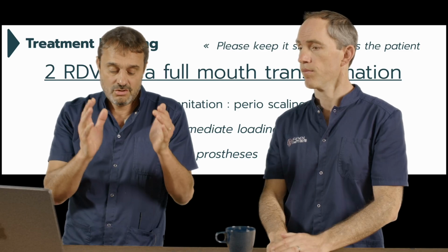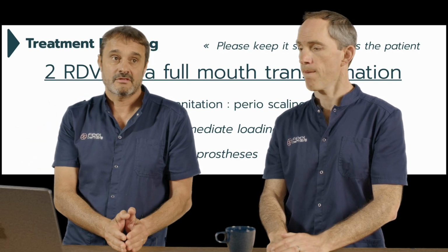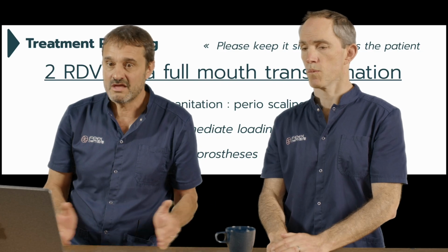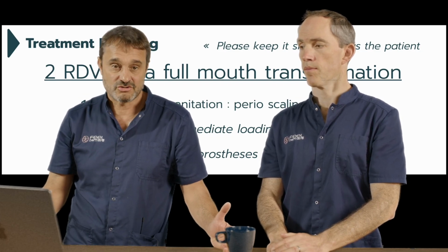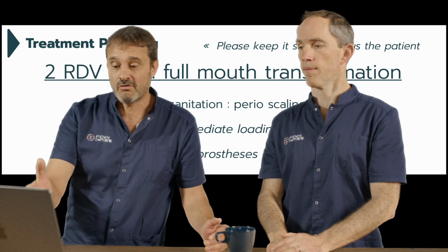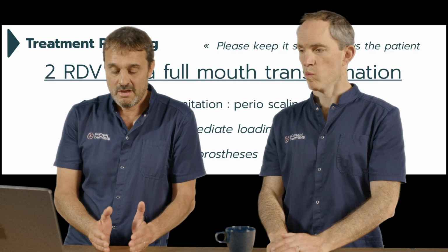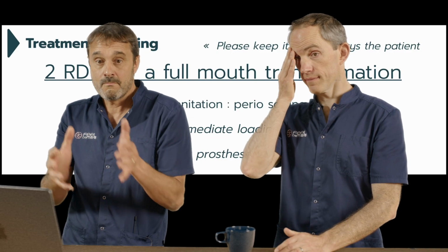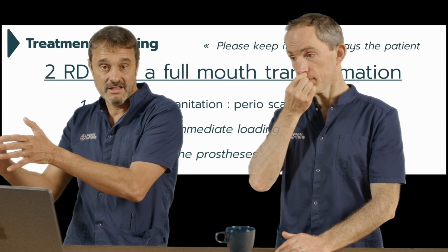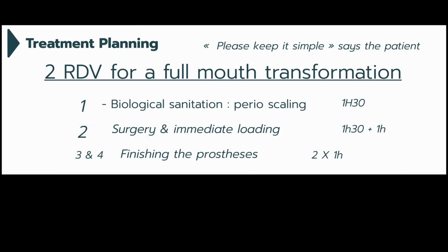Because you have a good organization, and thanks to digital, a treatment that would have been done without digital in maybe 10 rendezvous shall be transformed in a treatment in 4 rendezvous. And this is how you deal with economy. And because we will have been doing a good work before the clinical part, then the clinical part is very fast. And this is where you save money. And in this situation, we will treat the patient in 4 rendezvous.